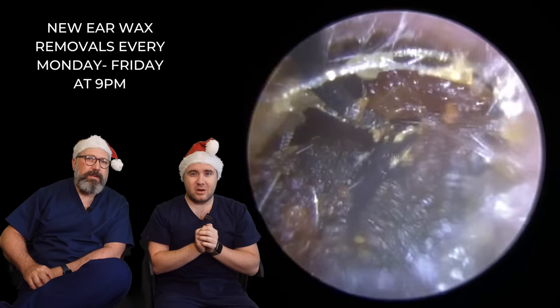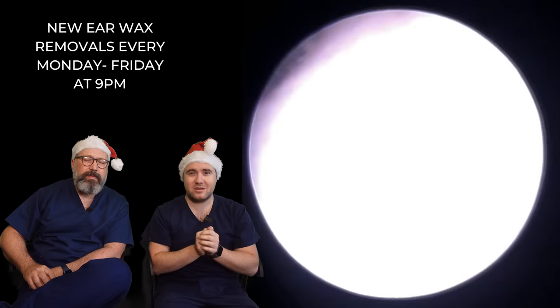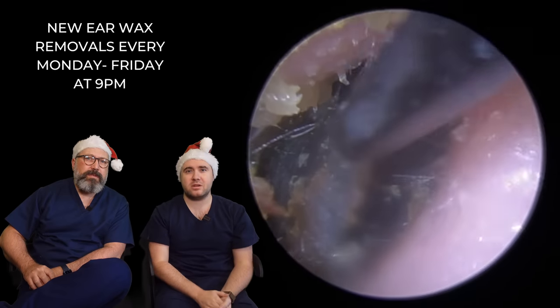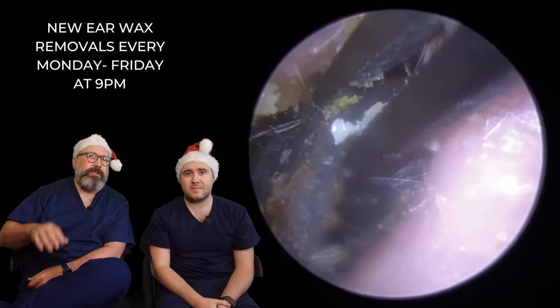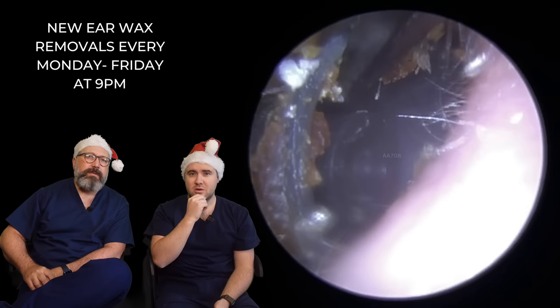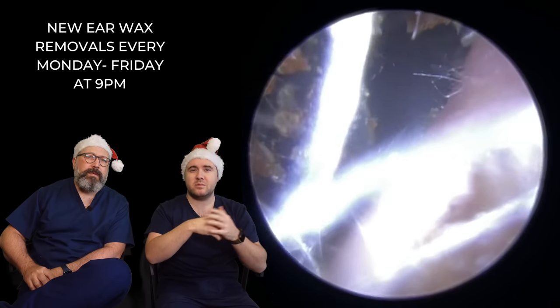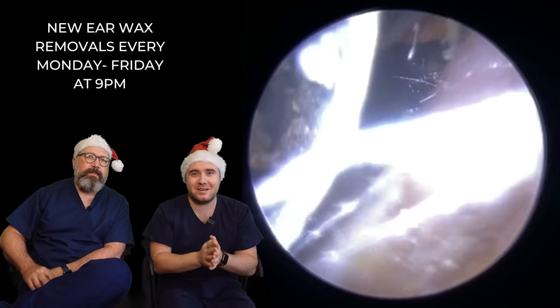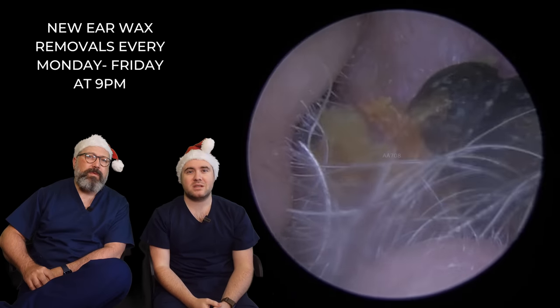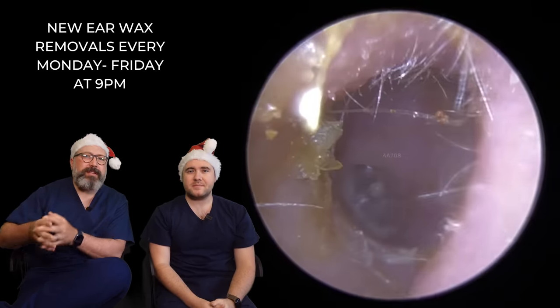Starting to go - there's a mixture of wax and skin on here, so we've got a bit of everything. We've got an edge here now, so I think this is where we go back in. Crocodile forceps back in here. Just that little skirt at the bottom - you can get a grip on there. Still going to pull this gently though, because anything in the ear canal, we don't want to just whip it straight out. We need to look out for the patient's comfort. So the dome has come away quite nicely. That's obviously been in there a little while, to have all that wax and skin collected around it.